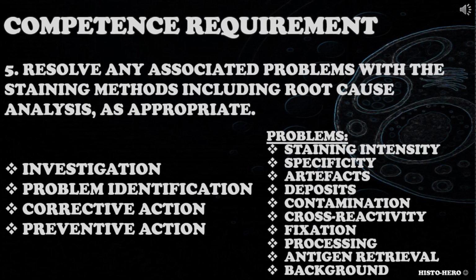The fifth competence requirement is resolve any associated problems with the staining methods including root cause analysis, as appropriate. Candidate should be able to troubleshoot staining. Does the candidate resolve problems with staining correctly? Can they identify and solve the common problems? Do they record problems and resolve accurately? Can they perform root cause analysis?